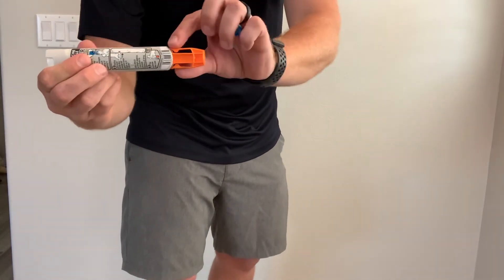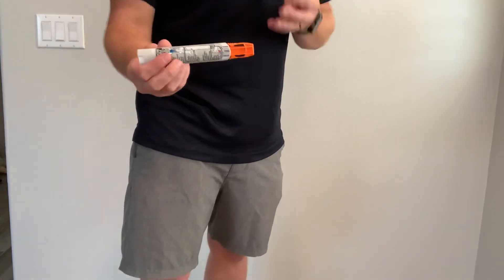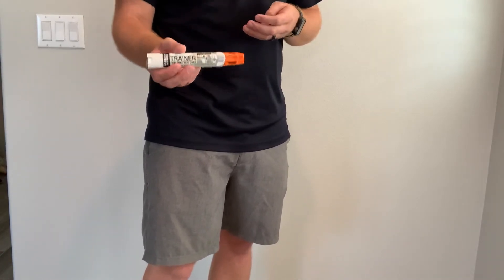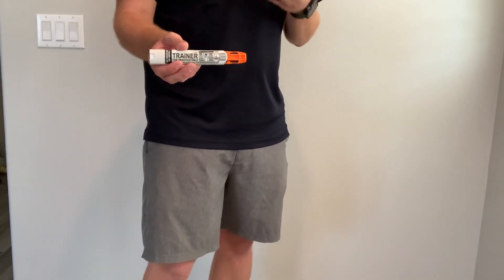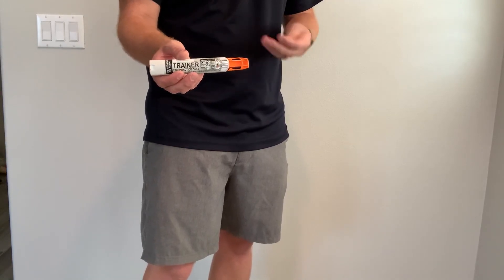The orange part is going to pop out to cover the needle, so you're never actually going to see a needle. This is still a 911 emergency, so we want to activate EMS and get help coming to treat that athlete after we've administered the EpiPen. This is going to relieve any swelling, especially in their throat, and help them breathe if they got stung by a bee or whatever the case may be.